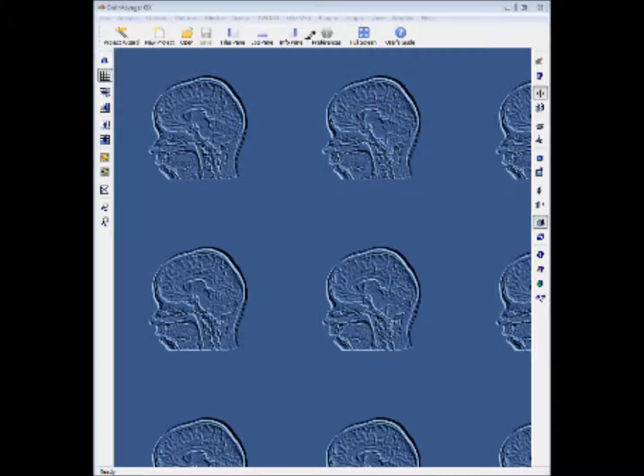This is part one of the BrainVoyager Getting Started video tutorial guides. In this first tutorial we're going to look at project creation.